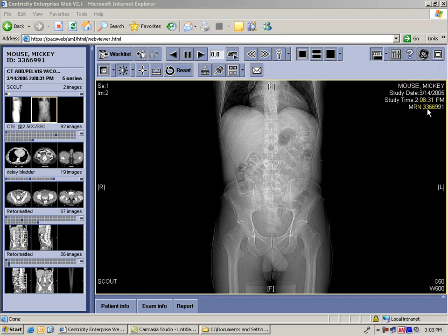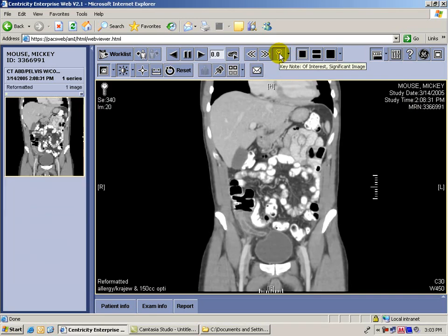So when you're at your PACS machine and you're selecting your images, you've got the information that you need to write your figure caption. I find it very helpful to select your key images. This particular PACS, we use 'select images,' and then when you go to the internet version of this, you can just click on 'key images' and it'll go straight to the image in question.